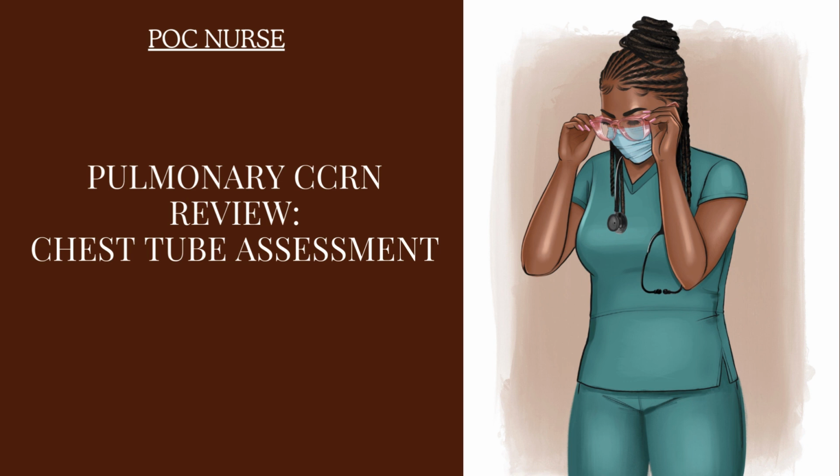We want to look at the Pleurovac, the box itself. You want to make sure that there is tidaling for one. Tidaling happens when the fluid in the water seal, there's usually a ball in there in the water seal chamber. You want to make sure that the fluid is going up and down gently. So you see that ball in the water seal chamber going up and down. Tidaling happens as the patient breathes. So when the patient takes a deep breath, the ball goes up. When the patient breathes out, the ball goes down. And this is normal.